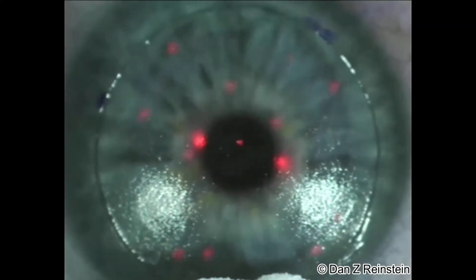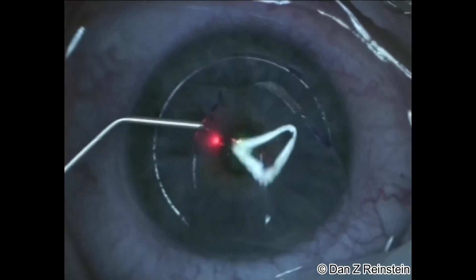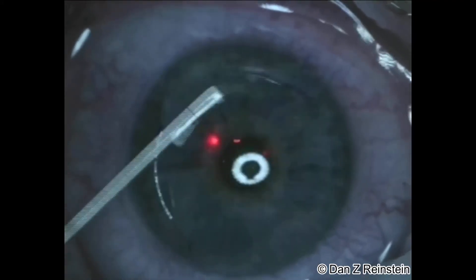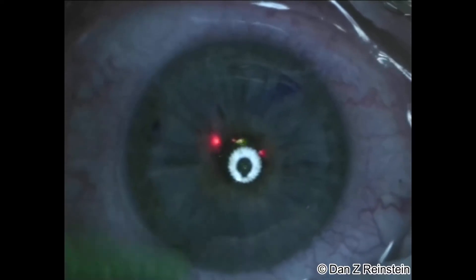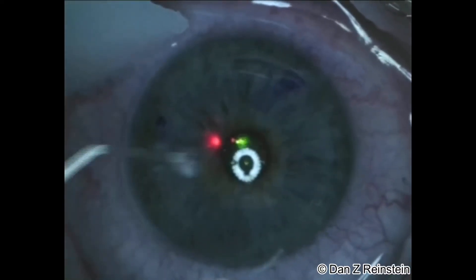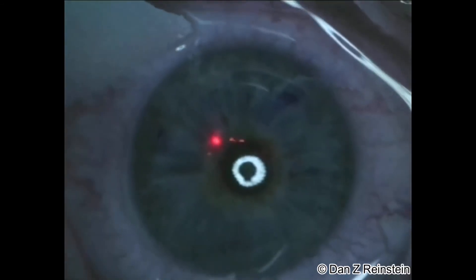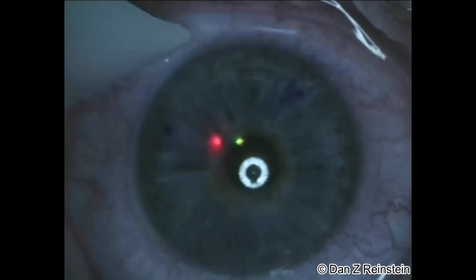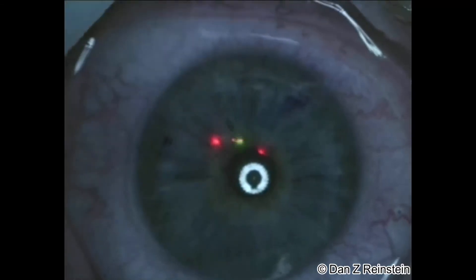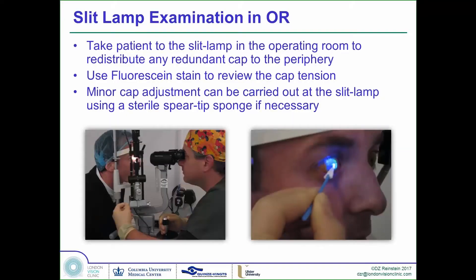We perform the ablation and return the flap. This is a standard LASIK flap repositioning technique. Our technique is to use extremely high pressure, high volume, but temporally short irrigation in order to get all particles out without hydrating the stromal component of the flap. We lay it down in a primary position based on marks placed before surgery, with a secondary flap repositioning performed a few minutes later at the slit lamp with heavy fluorescein in the eye, to ensure that the flap is 100% distended in its bed with zero micro-folds and no gap or gutter whatsoever at the end of the case.